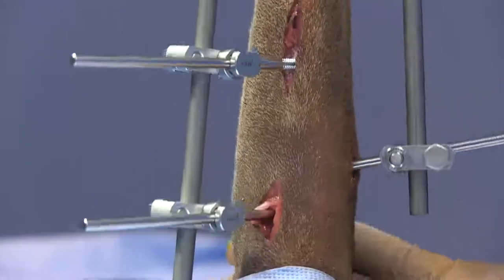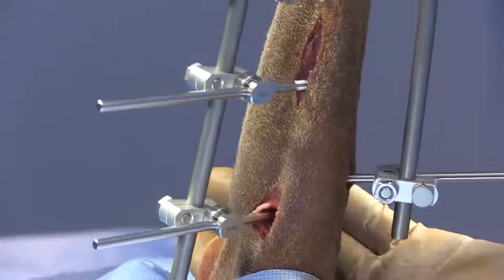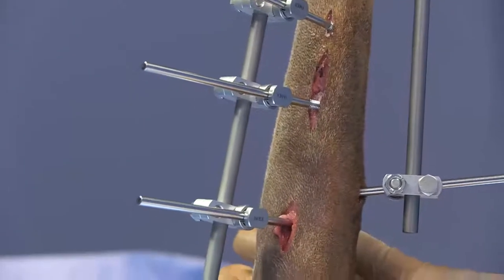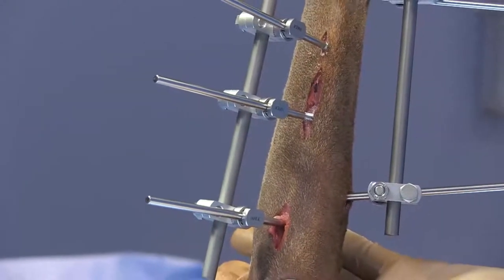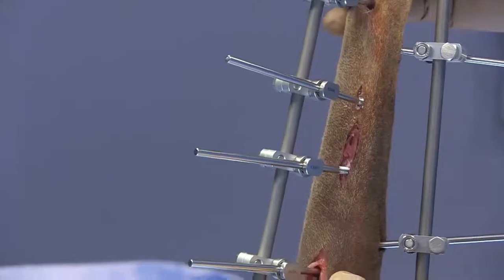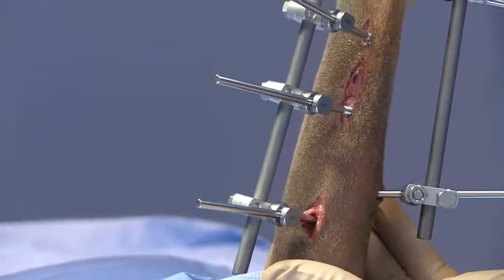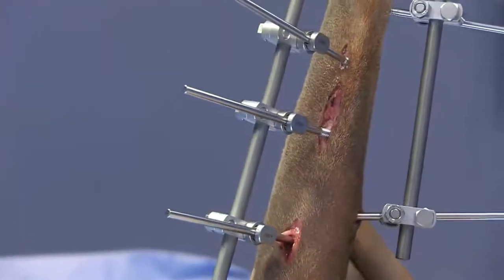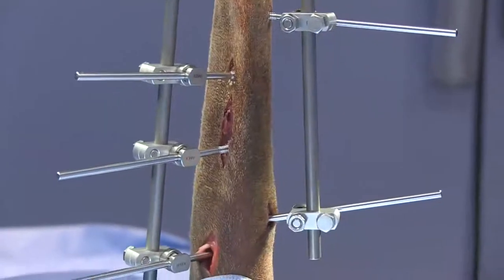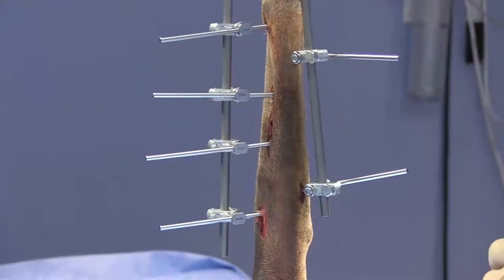If that pin is pushing and deforming that skin, it's best to go ahead and make yourself a slightly longer incision to reduce any complications related to pressure necrosis from those pin sites. You can see now when I flex and extend, that skin is no longer being deformed by those pin sites — so the expectation would be that we're not going to have the pin tract morbidity we would otherwise have. On the other hand, if you've got a site where the releasing incision is large, you can certainly place a skin suture or buried suture — just make sure you're not placing a suture that's causing any tension.